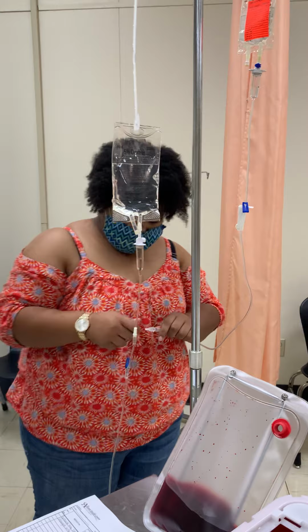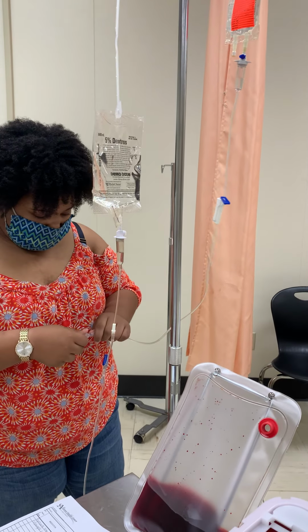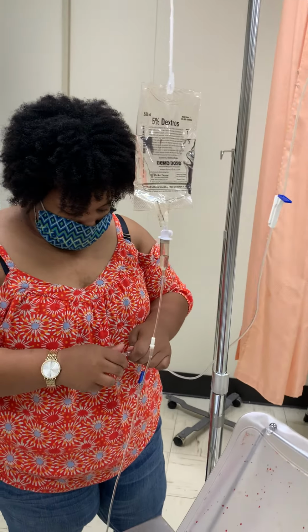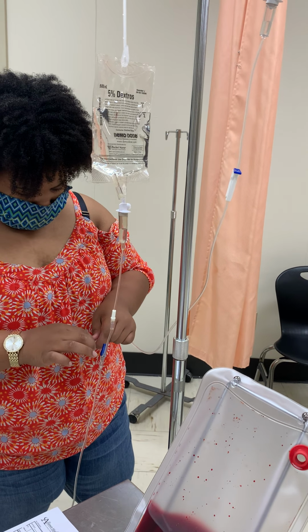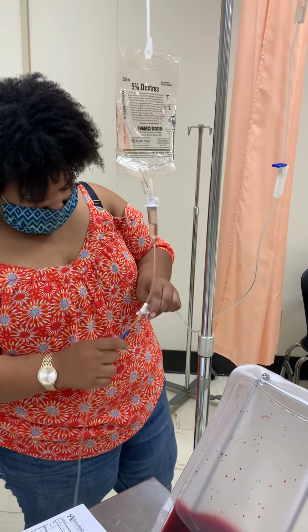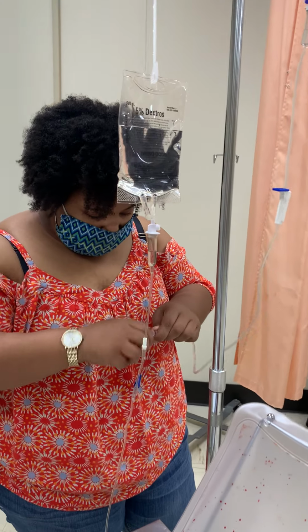Okay, and so I have this shut off. Okay, and I shouldn't have touched the, hold on, this top on here.